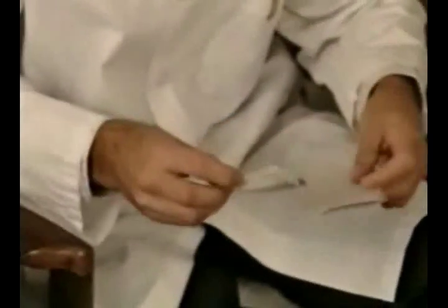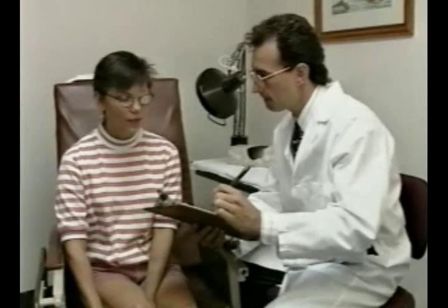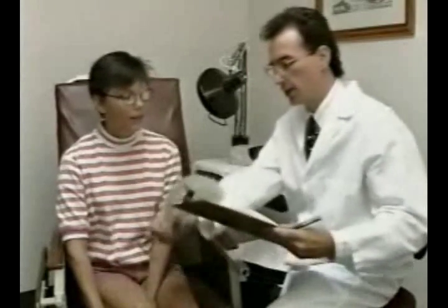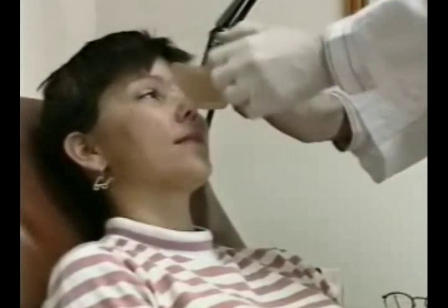Be sure to have your medical insurance card available, as well as the doctor's prescription we just discussed. Because all prosthetic work is done on a custom basis, it's important to clarify insurance or payment concerns before any work is started. Once the necessary paperwork is completed, the ocularist will want to review your medical history in detail, with emphasis on the circumstances leading to the removal of your eye. He or she will examine your socket for swelling and proper healing before the fitting begins.